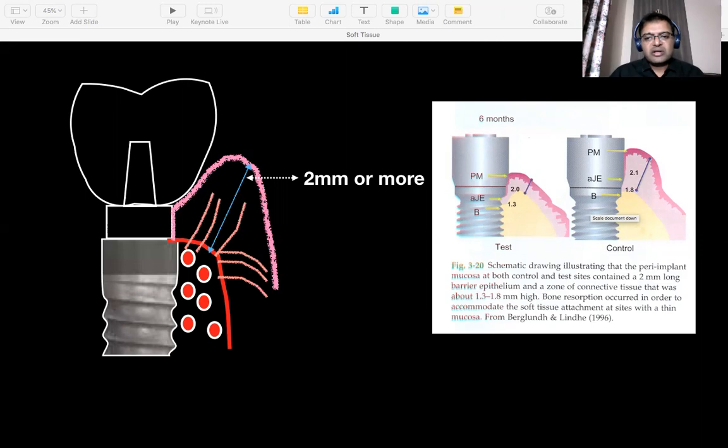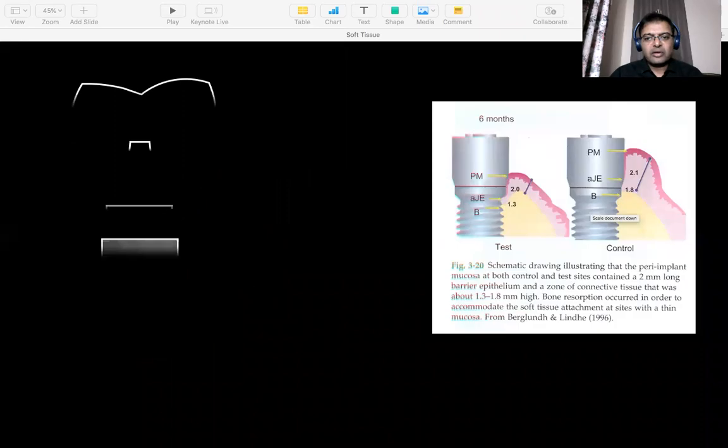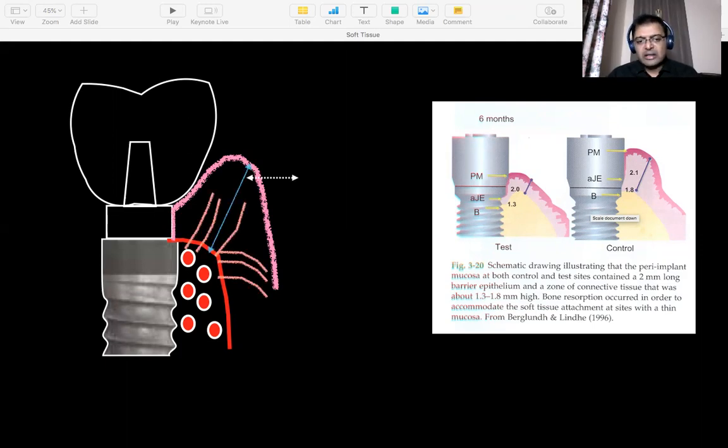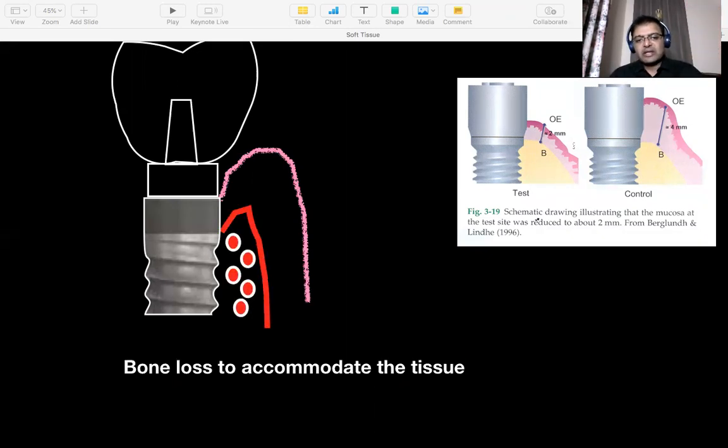Okay. In the older generation, when we had these machined implants, this bone loss was very classically staying down at the first crest. It remained there at the first thread. Whereas around the current modern day dental implants, if you start seeing crestal bone loss, and because the implant surface is entirely rough, the rough surface gets exposed to the outer environment as you see here. And if it gets exposed, then you can have a progressive bone loss. Around the machined neck, machined collar implants, if you have 2 mm thickness and if you lose the soft tissue, it can settle down one thread below and stay stable for the rest of the life.